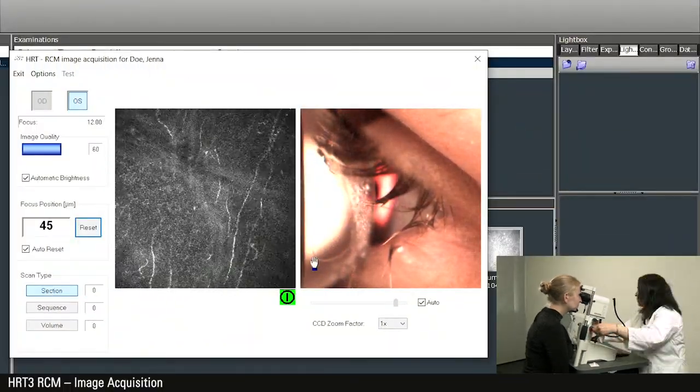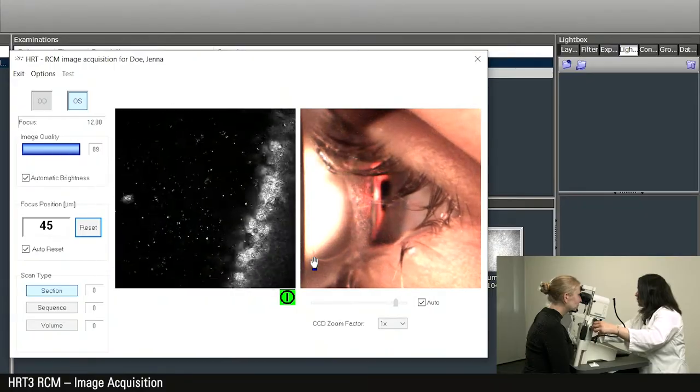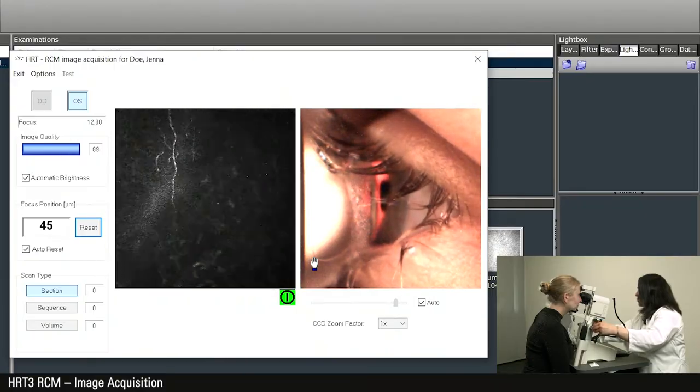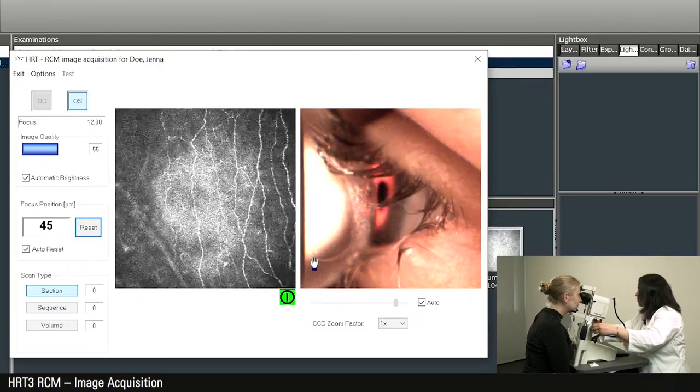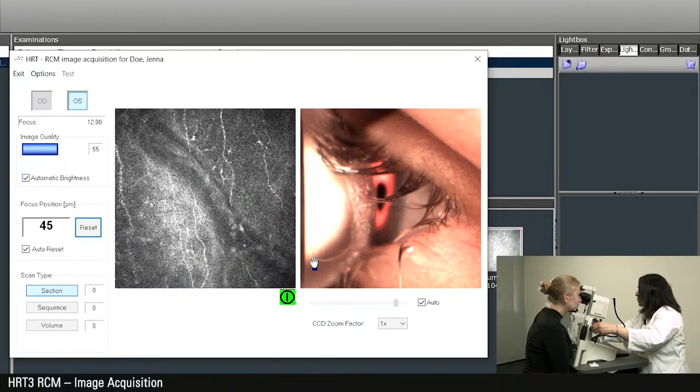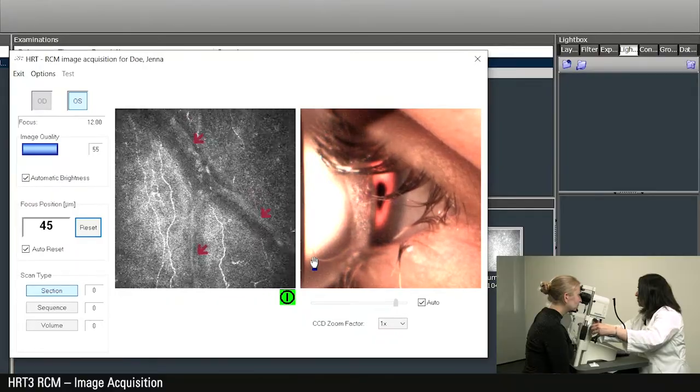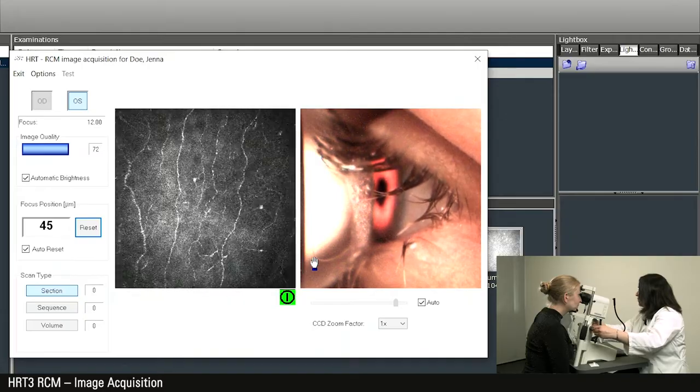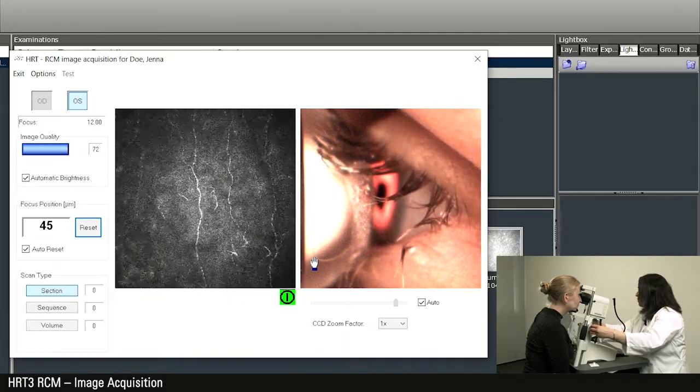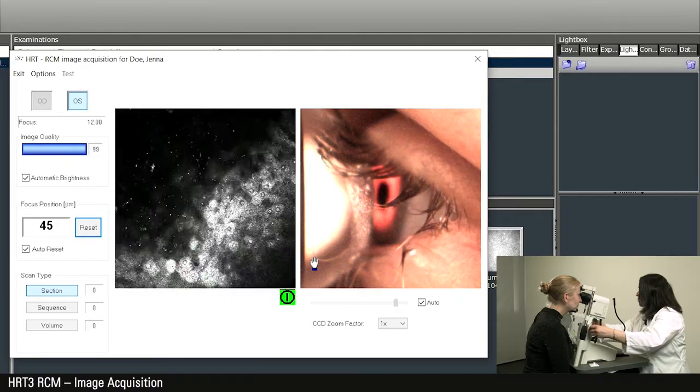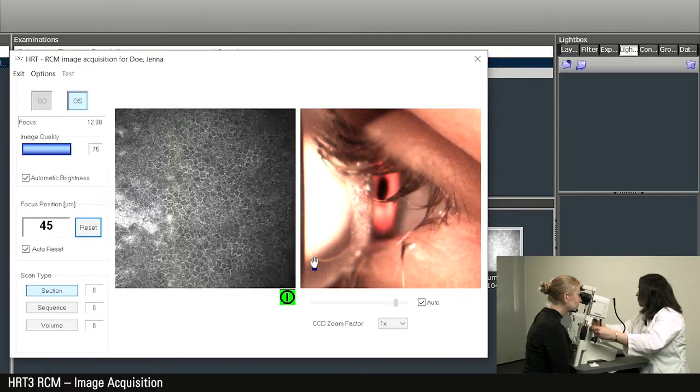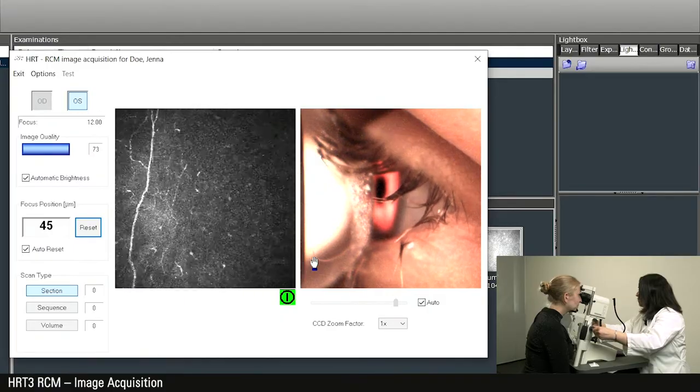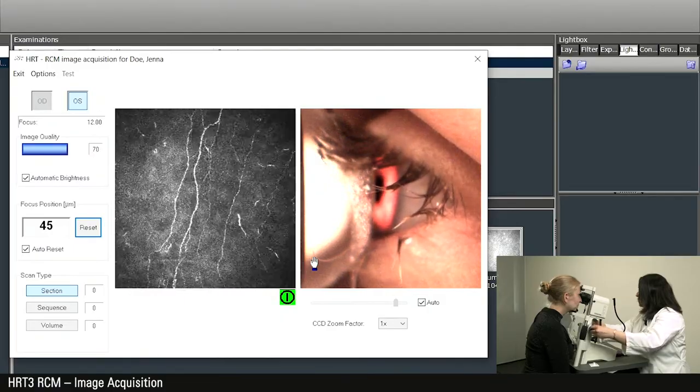If you start seeing vertical lines, you move the lower outer screw so that you can move the image laterally. If you see wrinkles, move the camera slightly back. In case you see horizontal lines, you have to use the inner lower screw so that the camera moves up and down to get rid of those stripes.